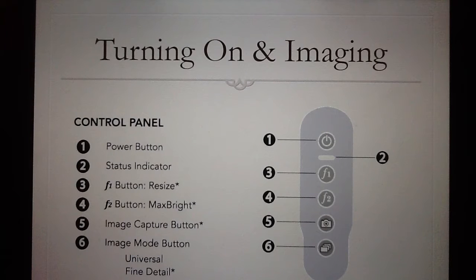On the display monitor, at the very top of the machine, you will see a series of buttons. Here you will visualize that I've labeled the icons, so it makes it a little more convenient for you to see. Power button, status indicator which shows the amount of battery life, resize button which gives you different views, max brightness which increases the light, image capture button which allows you to take live pictures and send them to your computer to show your coworkers, and the image button which gives you more fine, detailed views.